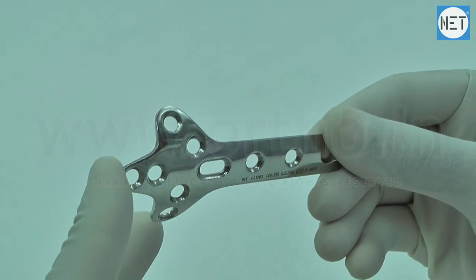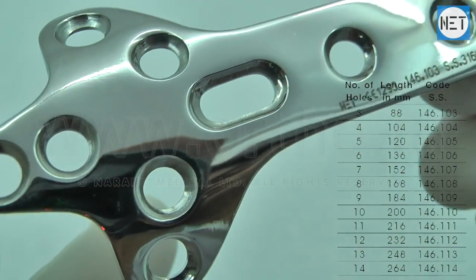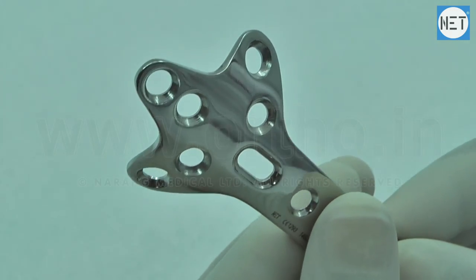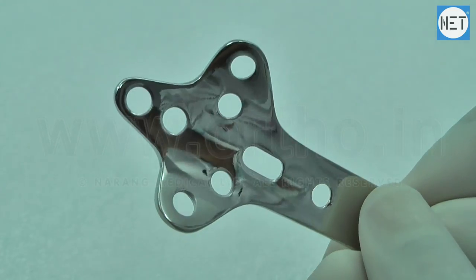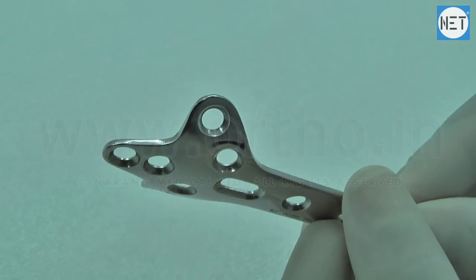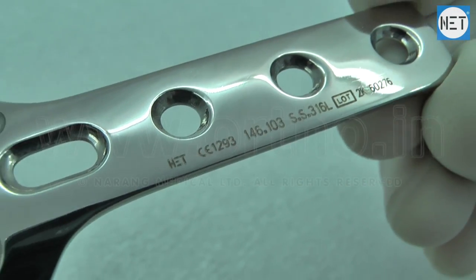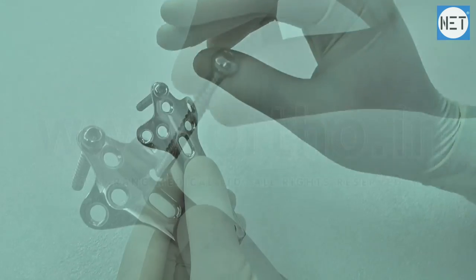These plates are available with number of holes varying from 3 to 14, and in lengths varying from 88 to 264 mm. These are available in stainless steel and titanium. All holes of the plate allow 3.5 mm cortical and 4 mm cancellous screws.